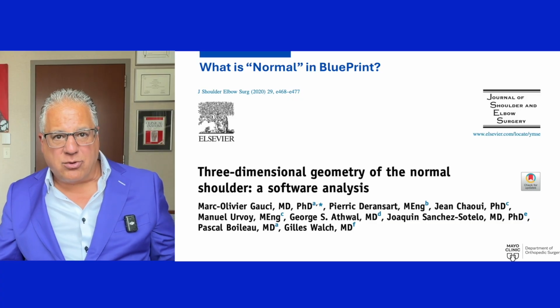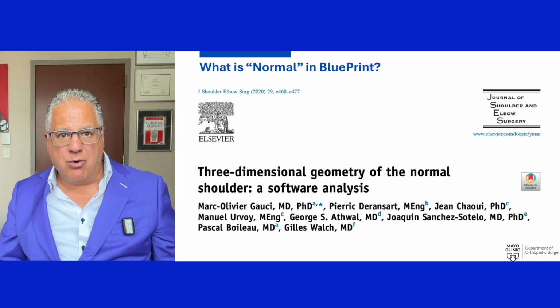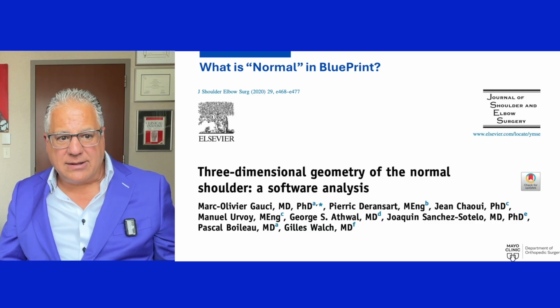One question that's important to answer is, well, if we upload the CT scan of normal people into BluePrint, what values will we get? We did this.